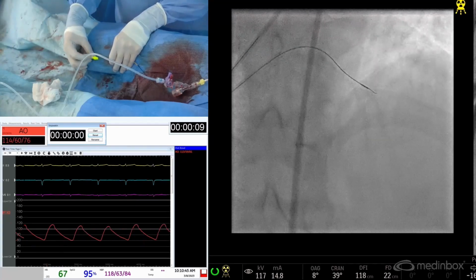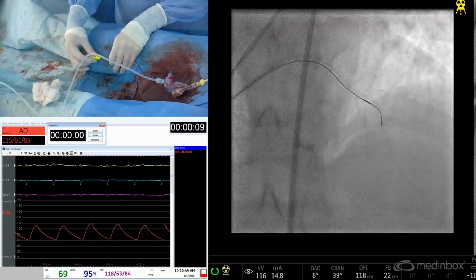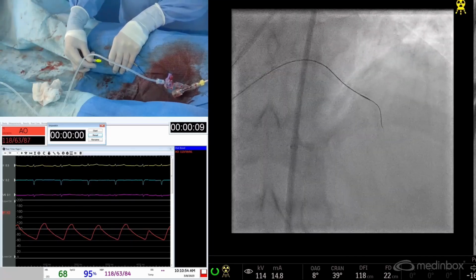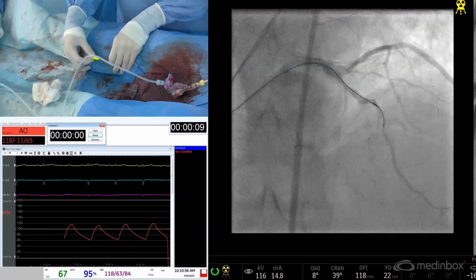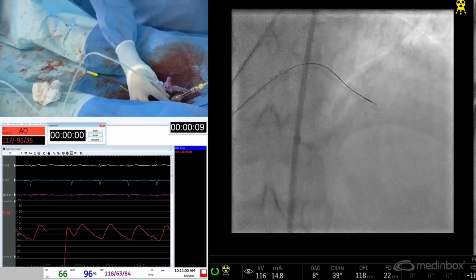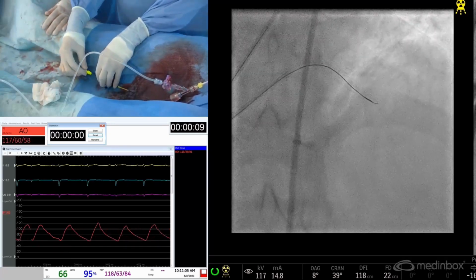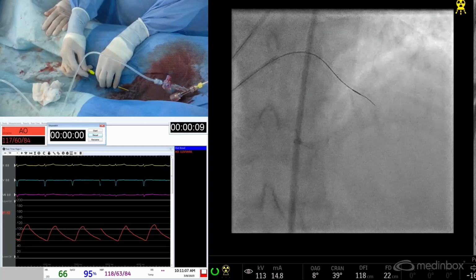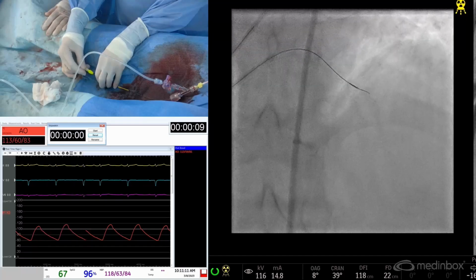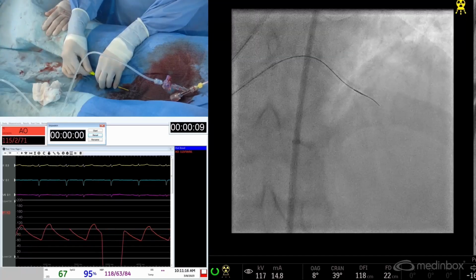It showed that the composite endpoint was much more favorable for intracoronary imaging, 7.7% versus 12.3%. So this is our intention, to go forward and try to wire this bifid LAD and get our way across the different planes of this dissection that was left from previous attempts.